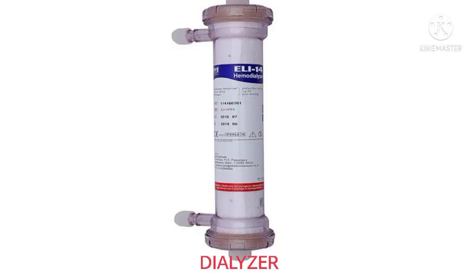Hemodialysis apparatus: dialyzer, dialysate, blood delivery system. The dialyzer is the artificial kidney. Several types of dialyzers are available, including flat plate and hollow fiber models. There are differences in solute clearance rates, for example urea, creatinine, and large molecules, as well as ultrafiltration rates. Many centers that perform long-term dialysis disinfect and reuse the dialyzer for the same client to reduce costs. The dialysate solution is altered to fit the client's need.